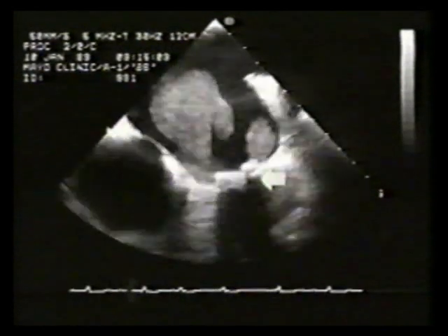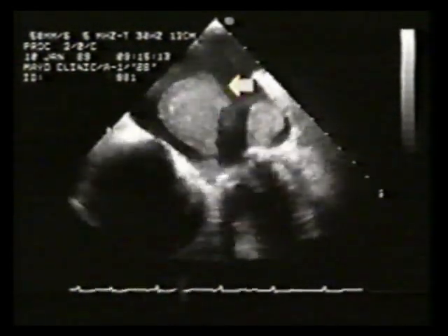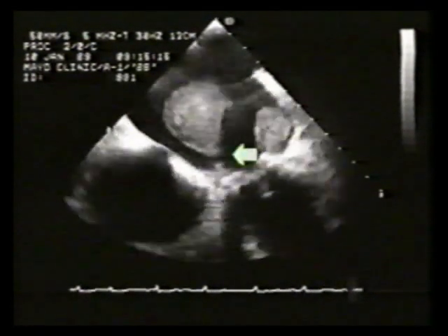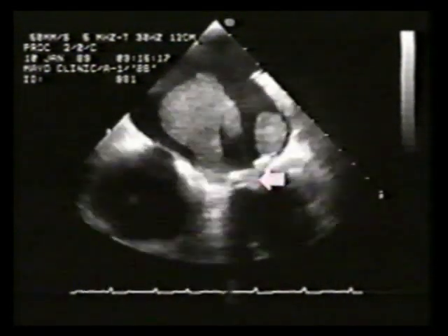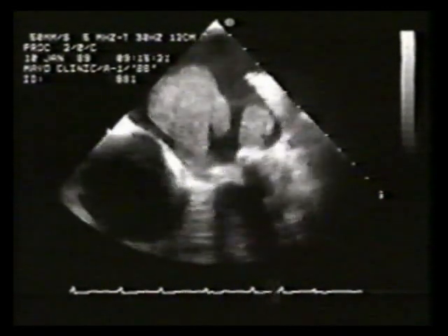On a transesophageal frontal four-chamber view, impressive amounts of thrombus are visualized in the left atrial cavity. These were missed by the transthoracic exam. Notice the relative immobilization of the heterograft cusps, consistent with stenosis.